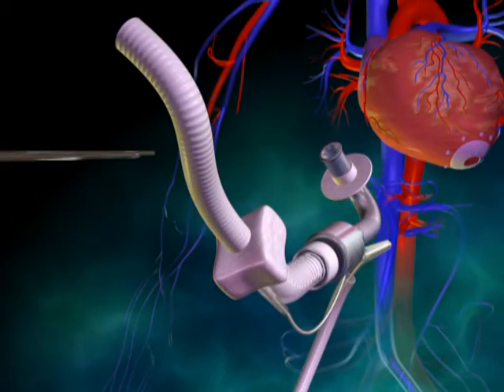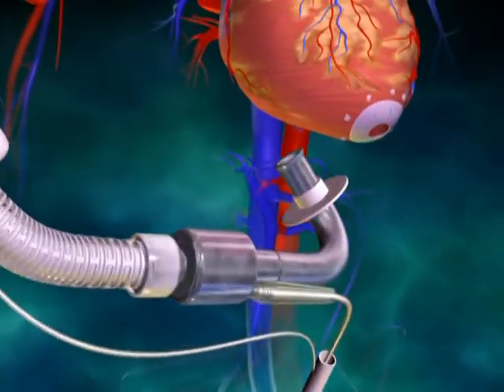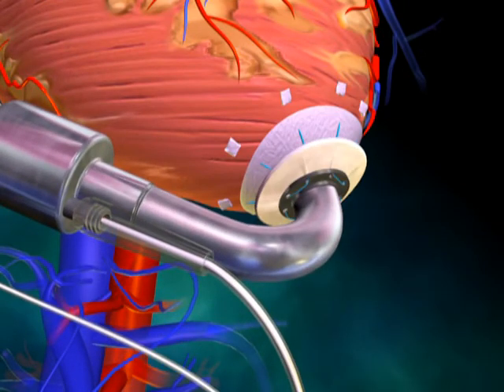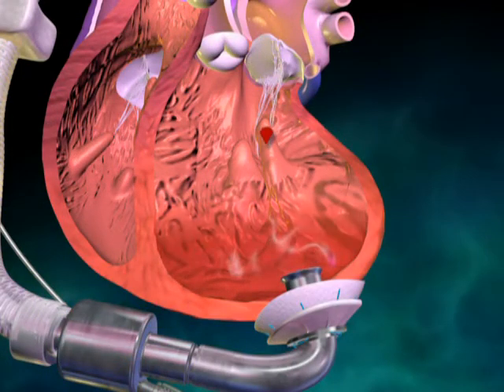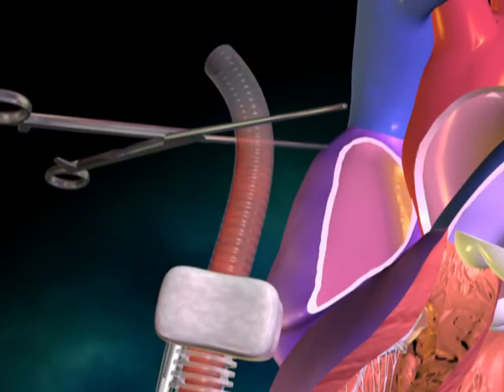The outflow graft is then clamped, and the inflow cannula is placed within the apical opening. Prolene sutures are again used to attach the suture ring located on the inflow cannula to the previously secured apical fixation ring. Fill the left ventricle and allow the HeartAssist VAD and outflow graft to fill with blood.